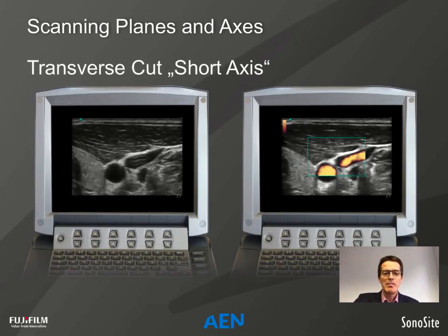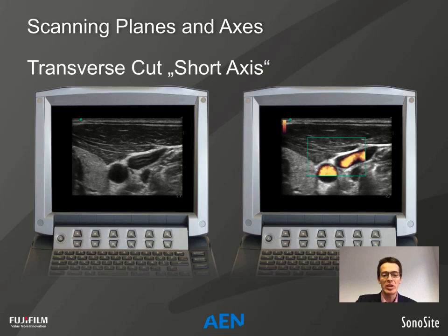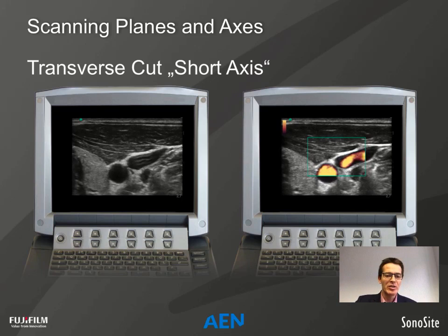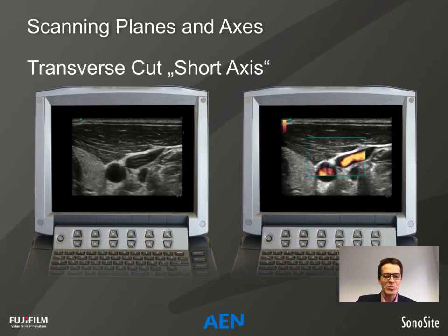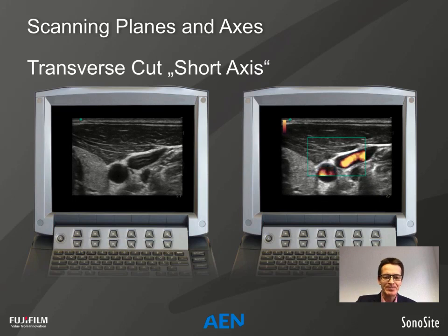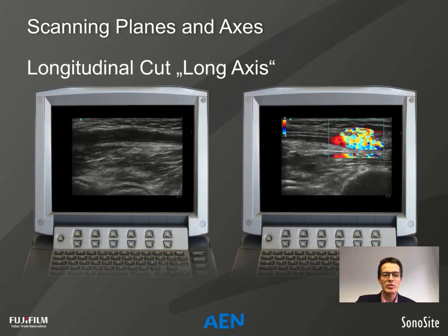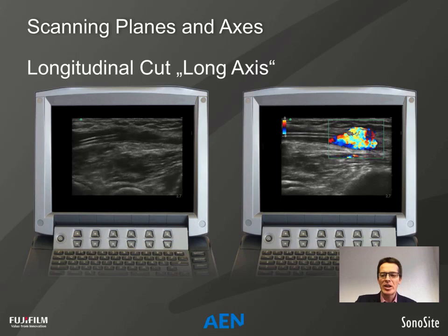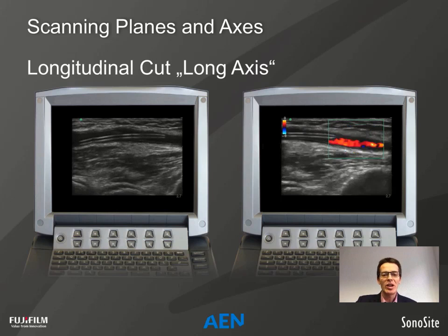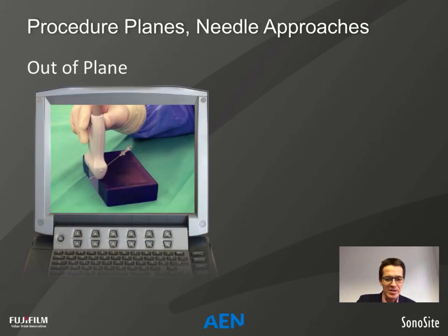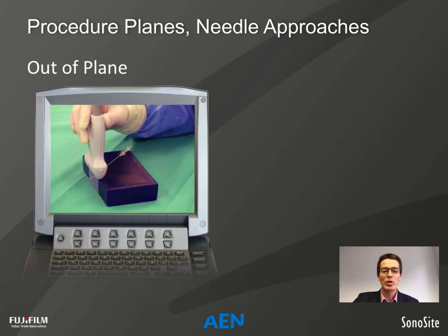To start, we cover some basic information. We look at the lateral neck on these two videos in a transverse cut, also known as short axis. The other term we need is a longitudinal cut or long axis, shown here on a radial artery on the mid forearm. In contrast to this axis terminology — which refers only to anatomy — we also talk about planes, which refer to needle guidance in relation to the scanning plane, not to anatomy.